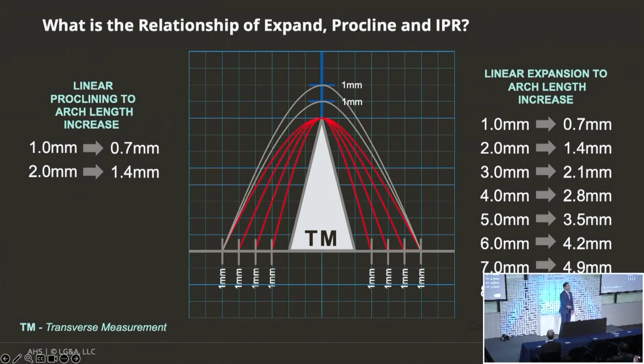the posterior teeth alone? On the left side, I'm adding in a little bit at the front. You have the benefit of both, the back teeth and the front teeth. You have 3 spots to look at, right side, left side, front. And if you can bring those numbers to add up to the IPR, which now you'll see every case can have that opportunity. You don't need IPR.